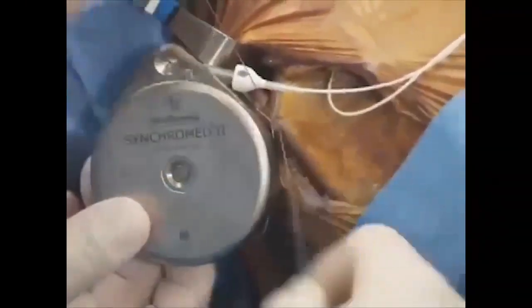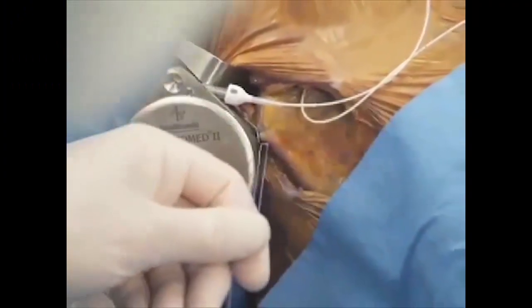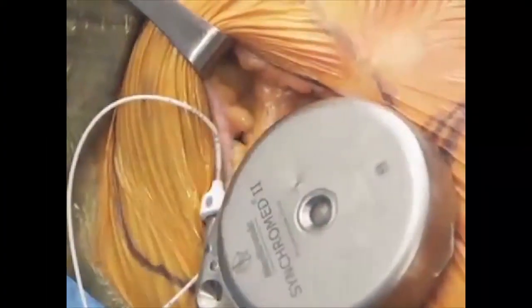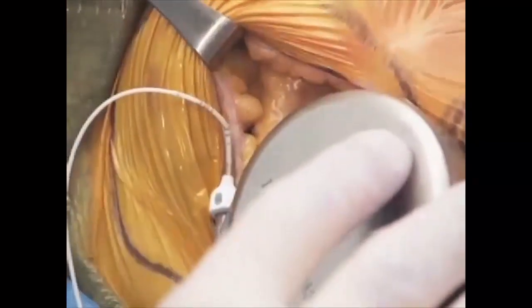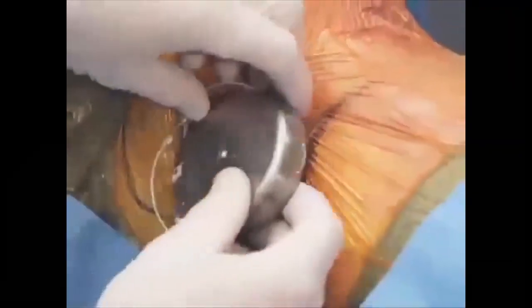Be sure that the center reservoir fill port is facing outward, and that both pump ports are positioned away from the incision site. Next, carefully coil the excess catheter under the pump. Make sure that there are no kinks in the catheter, and that the catheter is away from the reservoir fill port and catheter access port to avoid puncture during refill and catheter access port procedures.